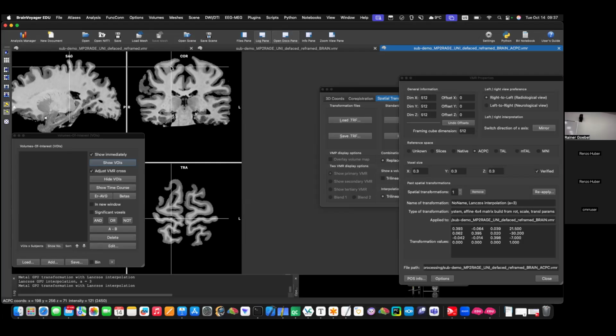Then it will open the new file automatically after the installation. But of course, it has a file that partitions it in subcubes, and they're always new data. So it's trained on hundreds of data sets, which are these cubes. It's a trick actually, to augment the data without inventing fake data.